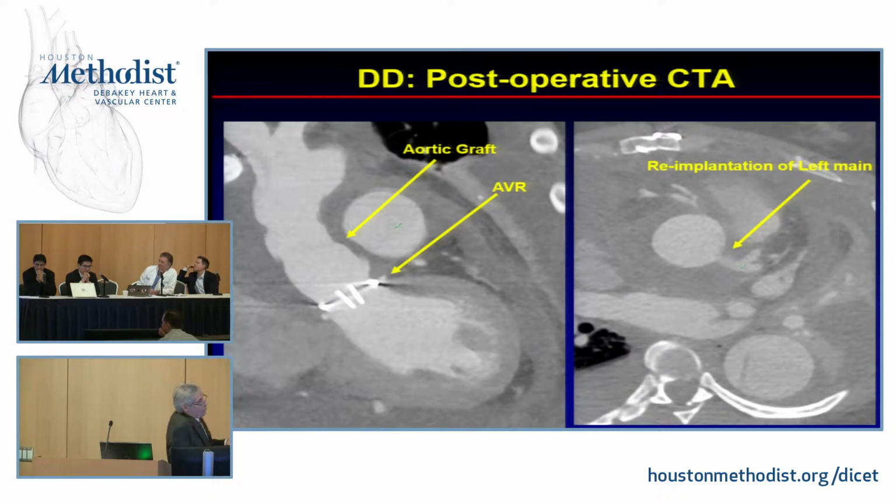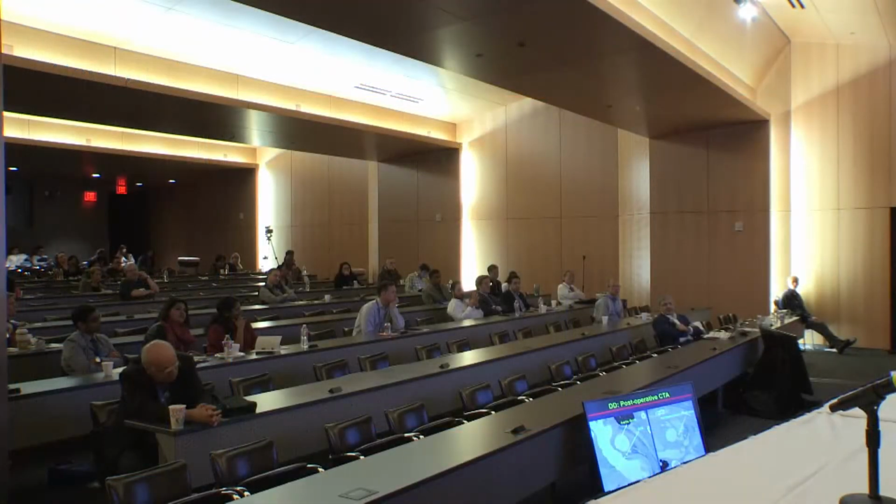Okay. So if it was done automatically, does it add anything to your interpretation of this? Well, this is post-op now. Pre-op it wouldn't have mattered because she had her own valve still. Ultimately it will be useful, and we discussed AI for quite a while. One of the discussions was to build an image library of medical devices. It doesn't exist, by CT, MR, or fluoro, which would let you automatically match up what device has been implanted.